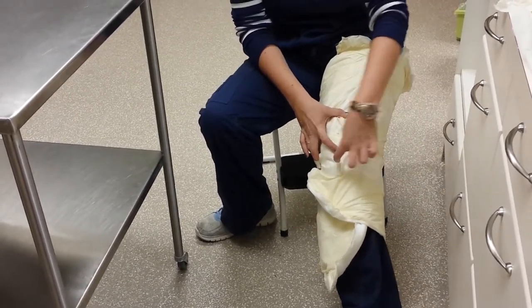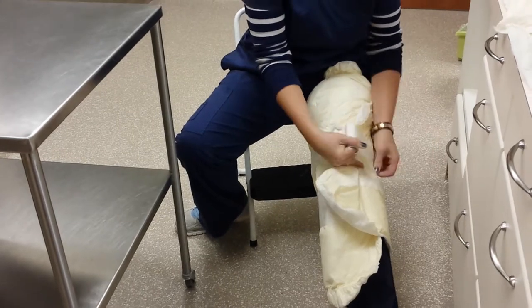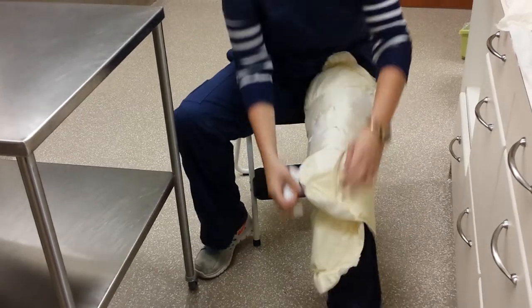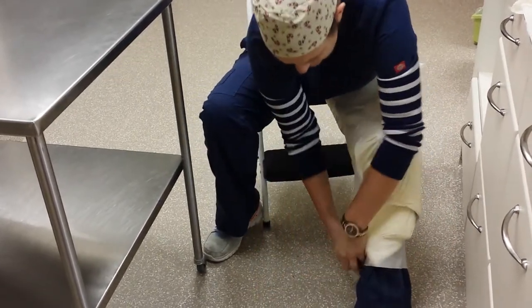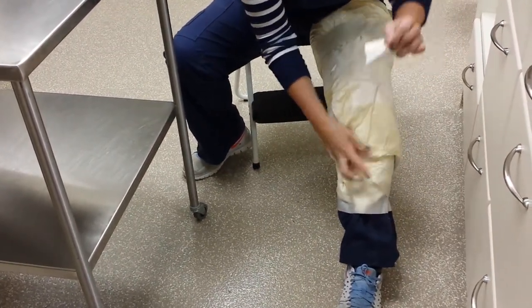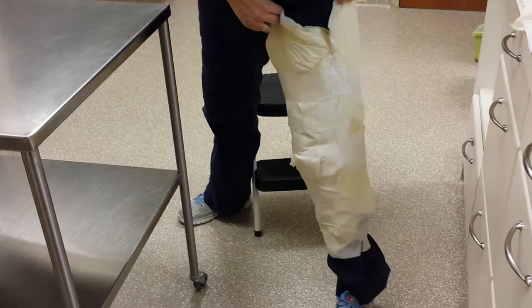It's going to take care of your holes which are placed along your kneecaps, placed along the edge here. You've got a hole here and holes that are inside of your thighs. Then you can take your tape and just tape it to yourself. Make sure that you secure the bottom so that none of the stuff comes out. Tape it around but not all the way around your leg — tape it in more of a V shape so that you don't cut the circulation off in your leg. Secure any openings that may be there and you've got a leg dressing.